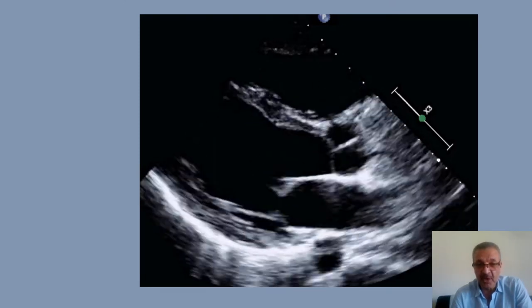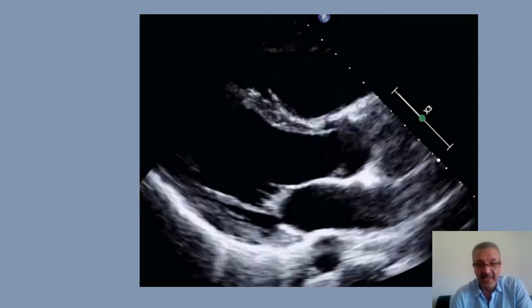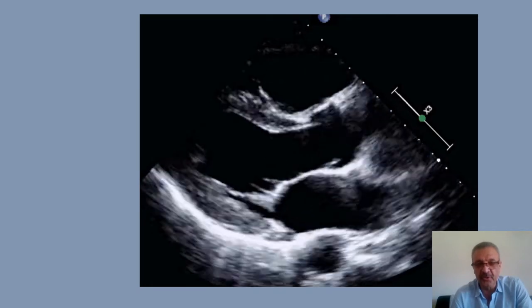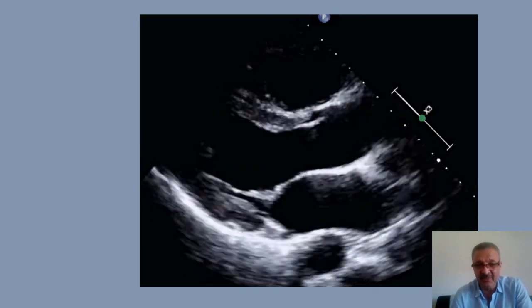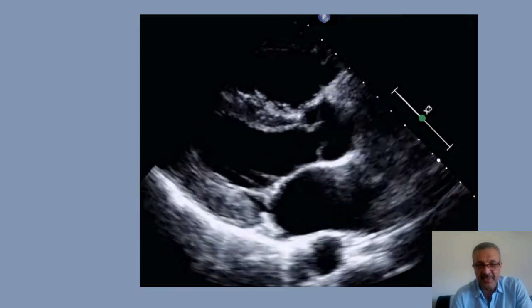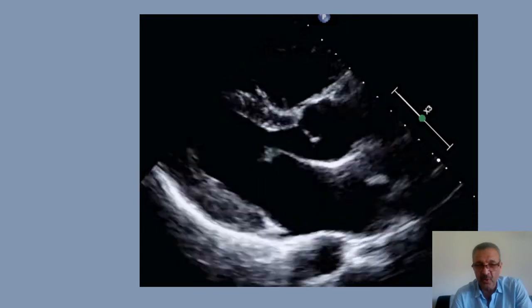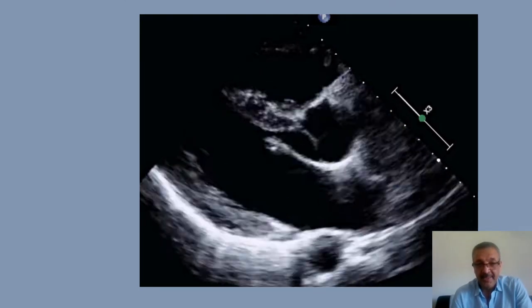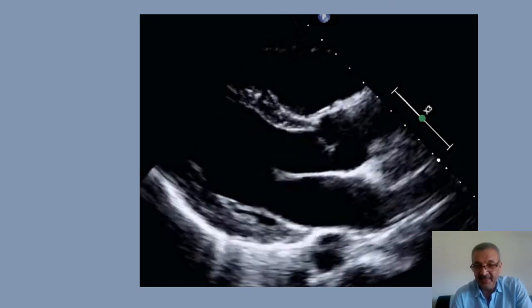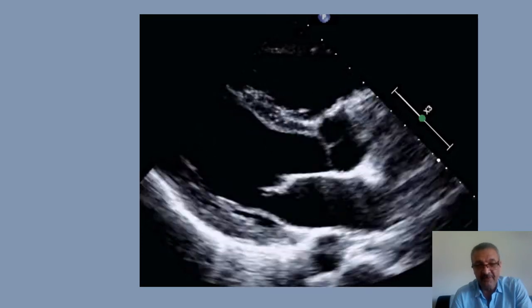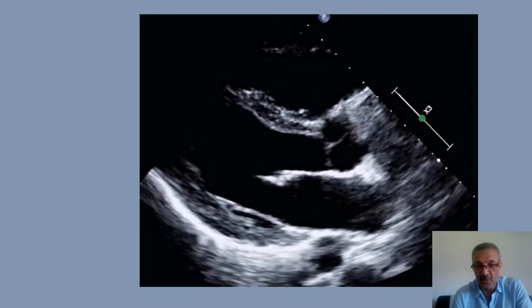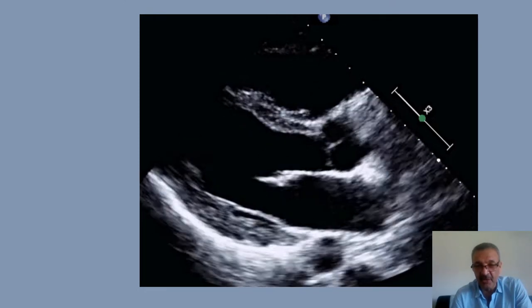Third, optimize your gain. As long as you see the endocardium, you are well optimized — doesn't matter if the image is hazy or noisy. Your target is that you see the endocardium on both walls. Then, make sure cooptation is at the center of the aorta. If the patient doesn't have a bicuspid aorta, the leaflets should close at the center.